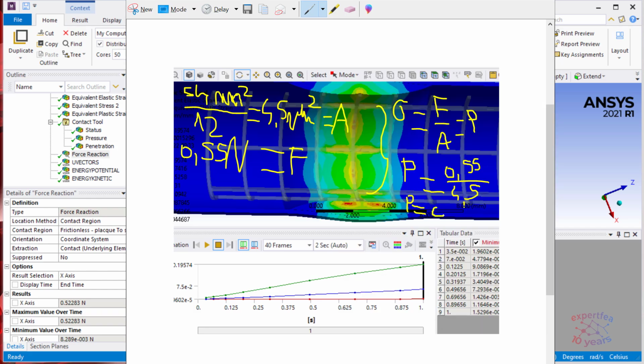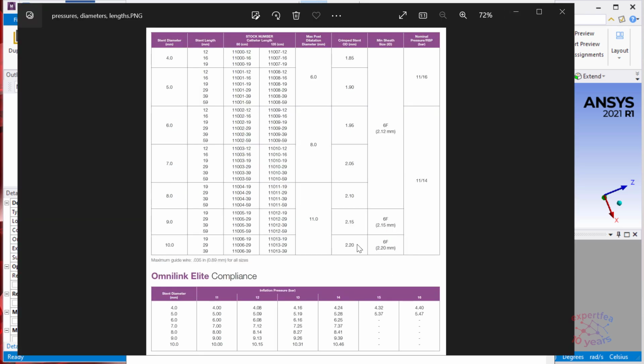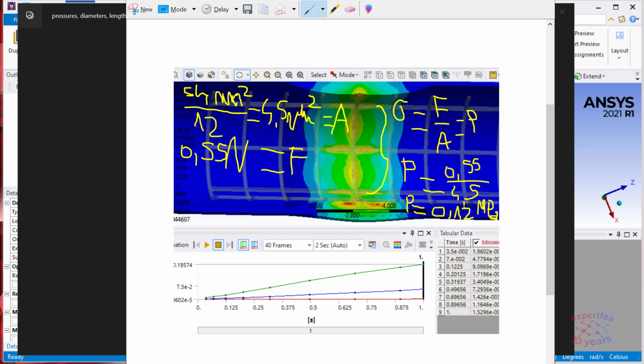0.12, yes, 0.12 megapascal, by the way. Yes, so this value needs to be compared with these values. So if we have around, you remember, let's say pressure from compliance is, I don't know, maybe 1.5 megapascal. We should get from the FEA a value that correlates with this one.